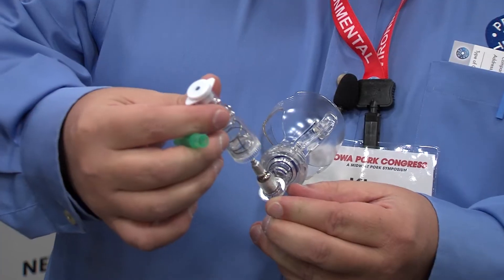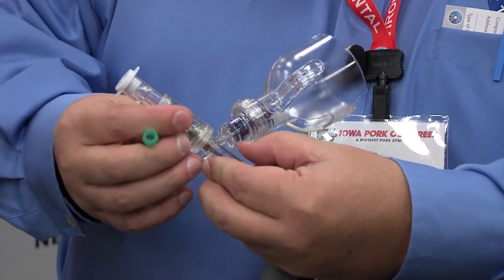We have a new product we're bringing in from Europe called the Stair-O-Matic. The Stair-O-Matic would place your needle on top of the slip here. This would slide on top of the needle and screws in place.